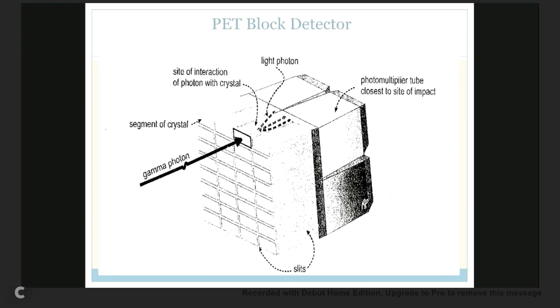Right, so this is exactly what it does. The photon comes in and strikes the detector, right? But the detector, remember, has those blocks within, what I just showed you in the last slide, and then it translates into your PM tubes over here. So scintillation occurs once it comes in and strikes the crystal that's there, and then the light is produced and goes into your photomultiplier. Okay?